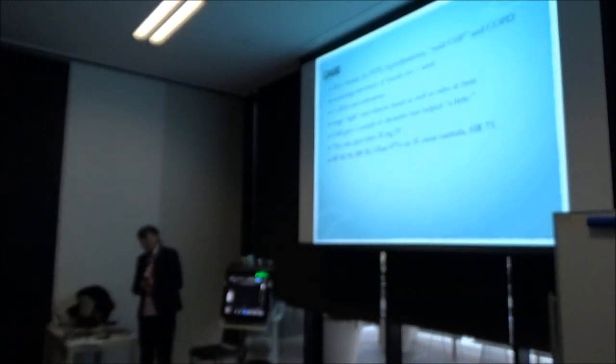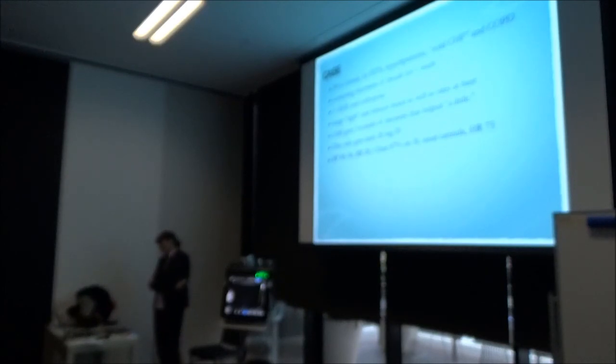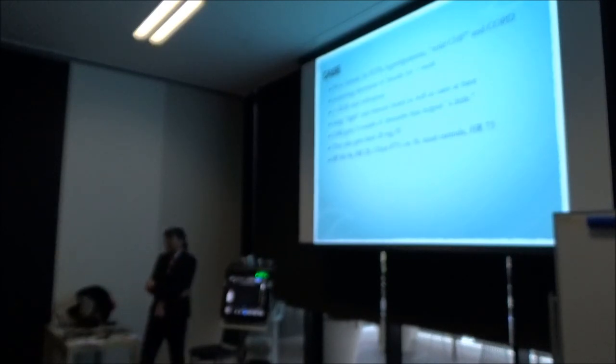A 90-year-old female with both CHF and COPD. I don't know how uncommon that is. That's like an everyday occurrence, where she's coming with shortness of breath, and she has both a wheeze and rales that EMS heard. And so they decided to give some DuoNebs, as well as Lasix. I don't know if they can do that here, can they? So they give both treatments, and she comes in hypotensive and hypoxic.